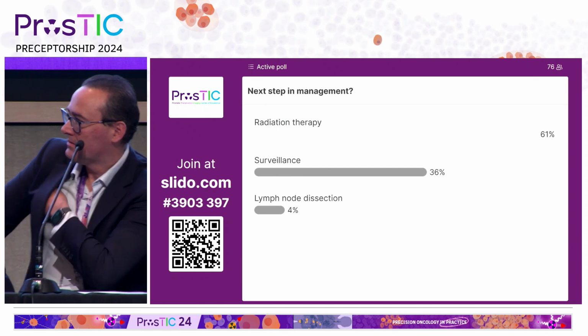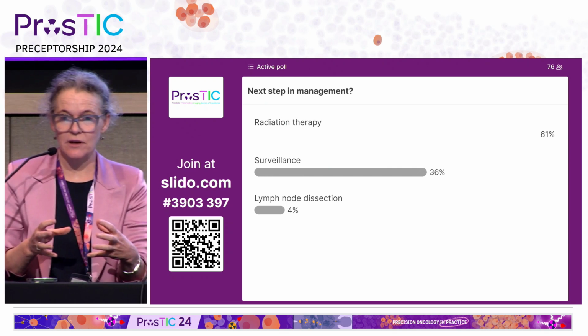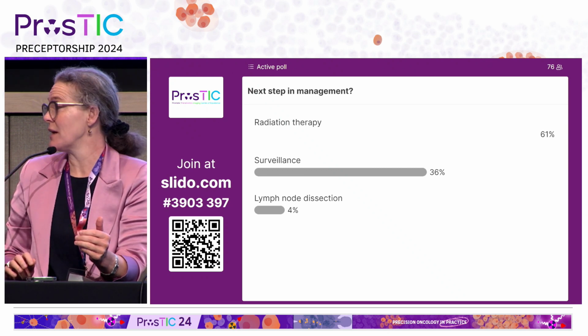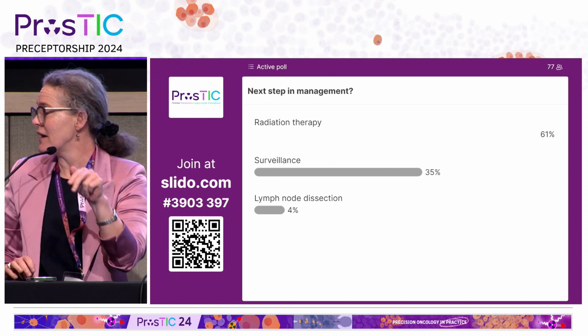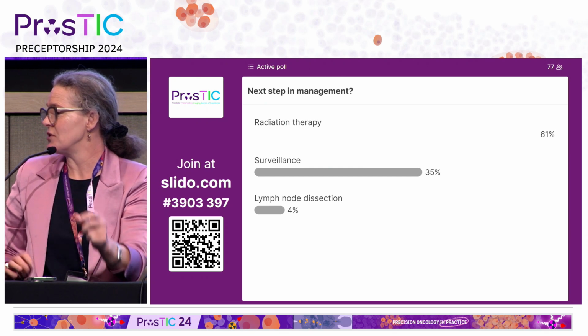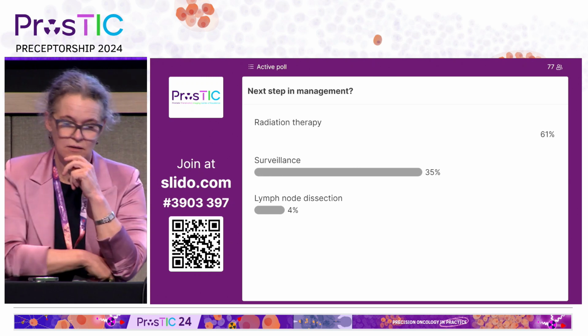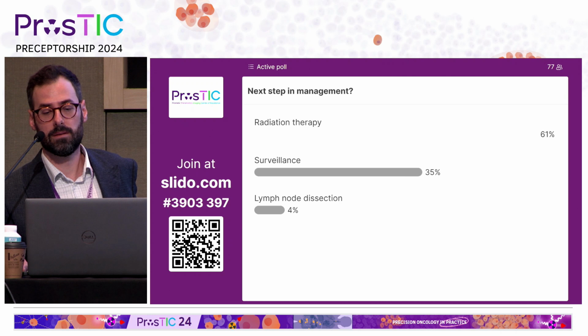One thing I would say on those 2 PSMA PETs is the bladder activity from the excreted tracer was very low in the first one and very high in the second one, and they possibly also had bladder involvement. So if I was reporting that PET, I would wind right down and actually have a look in the bladder wall to see if you get a difference there, which you can't really see on that. Yeah, we don't pick it up here. It could repeat, have a Lasix as well, just try to clear it out. That's a good point.